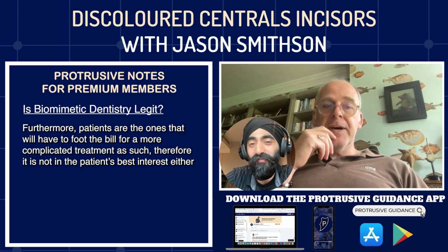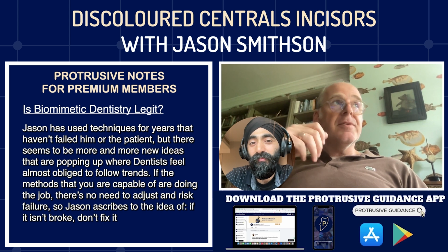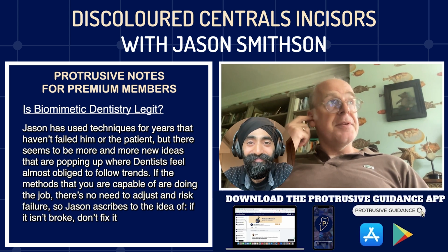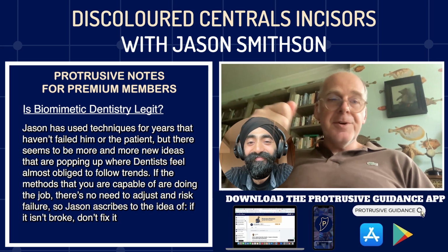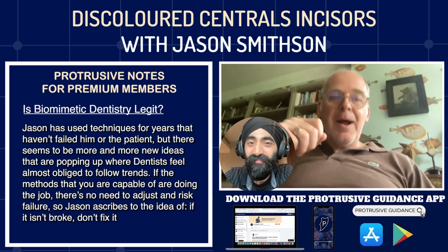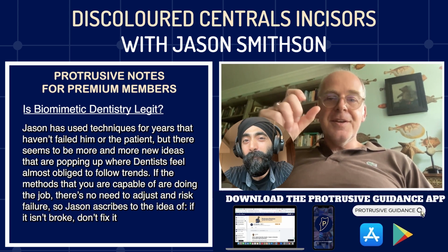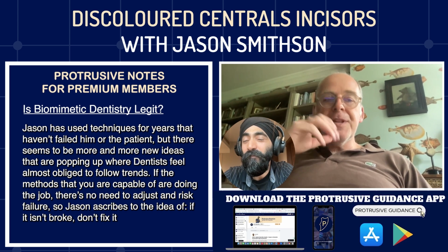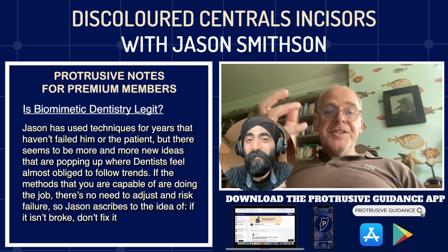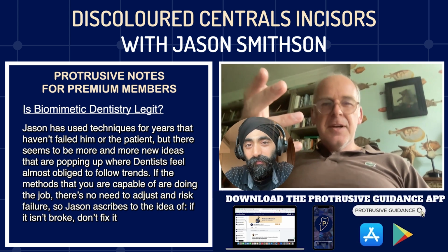when I first qualified in the early 90s, we used to stick, and this is no disrespect to the brand, because I still use the brand nowadays, a parapost burr down an upper central incisor and cut a nice parallel-sided prep, and then we also used to cut a lock into the coronal aspect. I wouldn't do that anymore. But to use your existing endo access and to put a post in there, what's the downside of that?